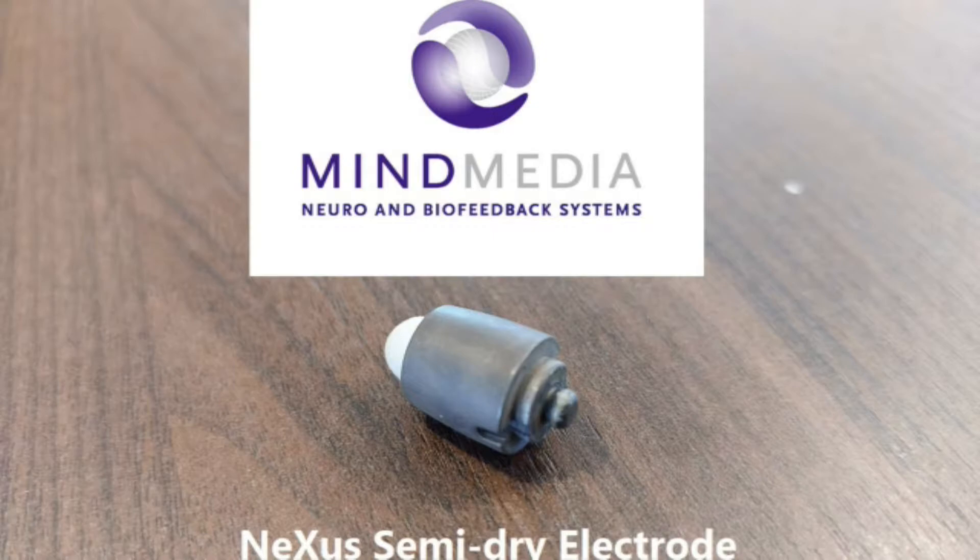I myself believe more in what we call semi-dry. What we have here is a semi-dry electrode — it's a saline solution, really. You click them into your cap, put them on the head, and they work because they are not dry. Semi-dry means they're not dripping with water and the gel is not running across your face, but they're wet enough to immediately make contact with your skin.